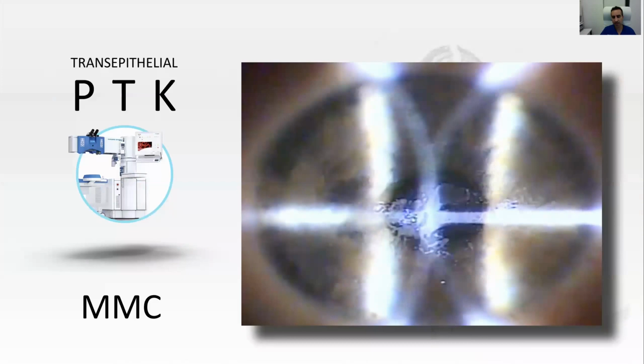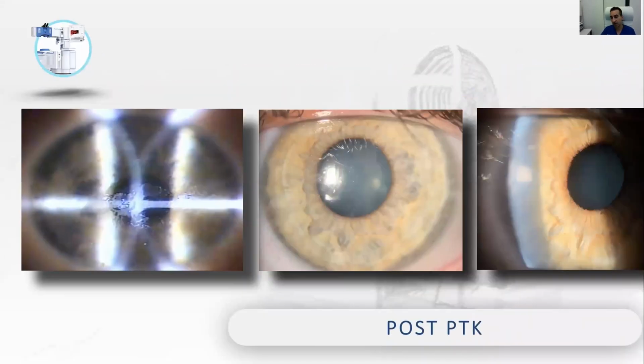And actually what we did was not relift the flap. What I did was perform a PTK treatment, debriding everything using PTK, and putting mitomycin C, because mitomycin C can sink all the way down. So whatever residual, especially at the periphery, because the center was pretty much shallow, but the periphery was a bit deep. I put it on the periphery because this flap is meniscal and was done probably using a keratome in an outside clinic. So the mitomycin C would take care of whatever deeper cells were available, but the central ones would be taken care of using the PTK.